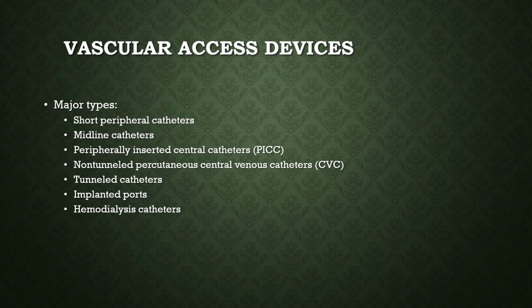We used to put IVs in the feet all the time. Now, because of circulatory issues and things like that, it typically requires a doctor's order for a patient to have a foot IV, but we used to do it on the daily, just about. Midline catheters are like PICC lines, but a little shorter term. We're going to talk about PICC lines, we'll talk about central lines, and then ports.